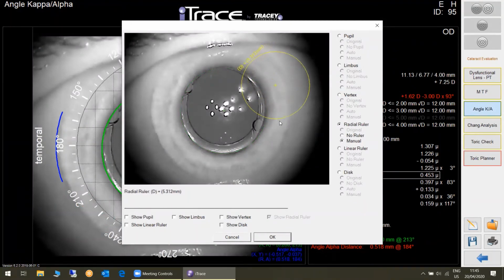Yeah, most lenses are 6 millimeters. Let's make a 6 millimeter. And I put it here. Do you think this lens is round? No, it's oval. You see? I asked him which kind of lens it was. He couldn't tell me. He said it's classified, it's a study. I asked him which material. He couldn't tell me. But then I showed him that the lens is not completely unfolded.